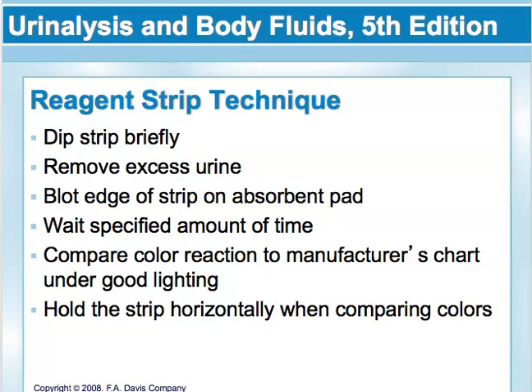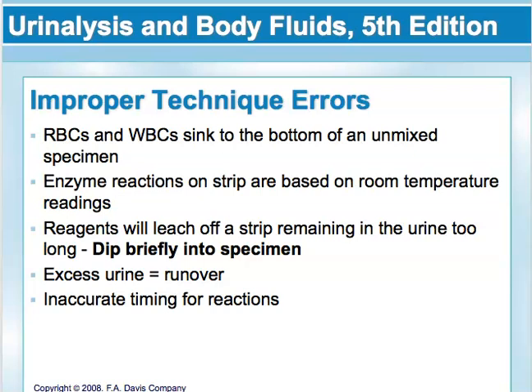You want to wait the specified amount of time for each test before interpreting the result, and each test does have a different amount of time. And for interpretation of the results, you want to compare the reaction on the reagent pad to the manufacturer's chart. You want to do this under good lighting and make sure to hold the strip horizontally when comparing the colors to the chart. There are some errors that can be caused by improper techniques, so you want to make sure that you're doing this properly.